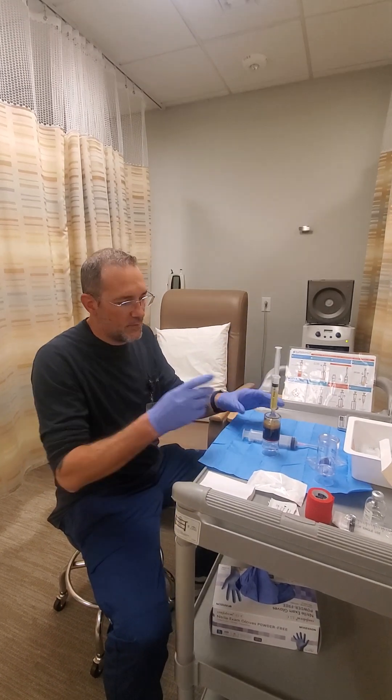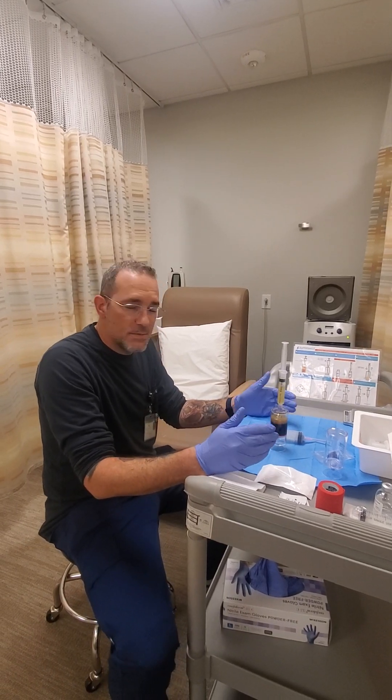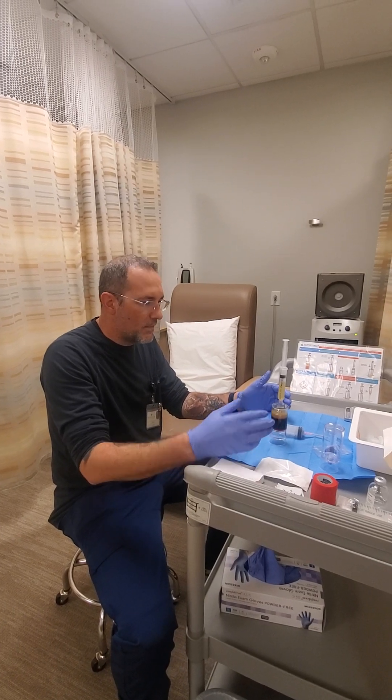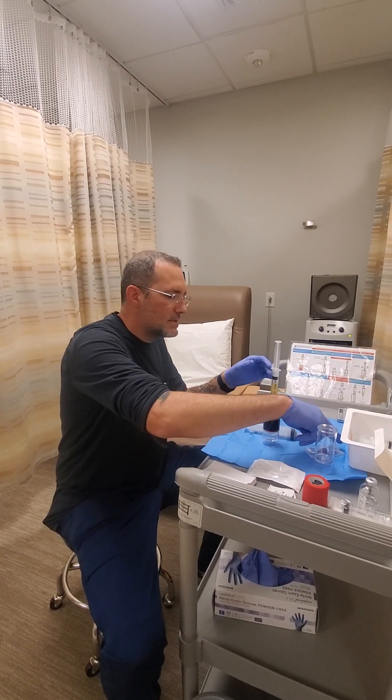I've pulled it out. At this point what I'm doing, I have a 12 cc syringe here. I'm removing the amount of plasma that will be used for the actual volume for the injection that Dr. Lockheed will be putting in. So I've removed that here, which I'm going to then set aside.